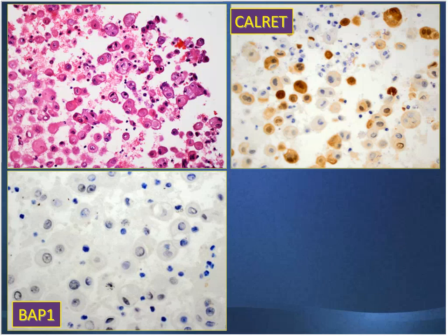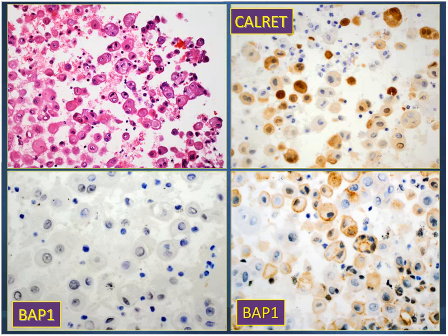But I can tell you that it is not as clear staining. You can have some areas that show cytoplasmic staining for this particular marker, which should not be considered as evidence, because cytoplasmic staining is not valid as a true loss of the nuclear antigen.